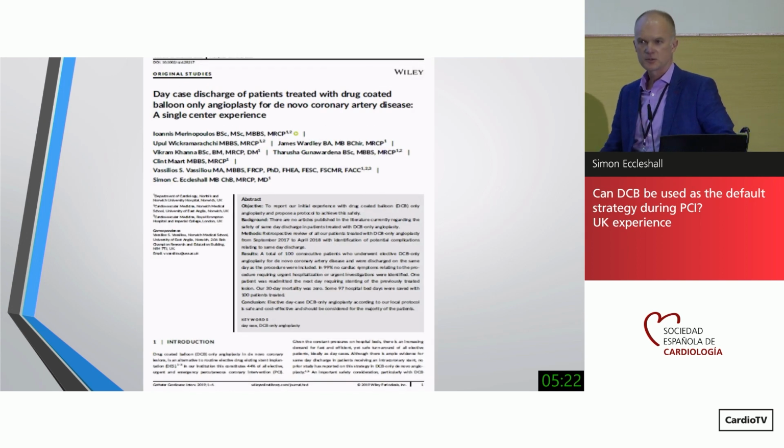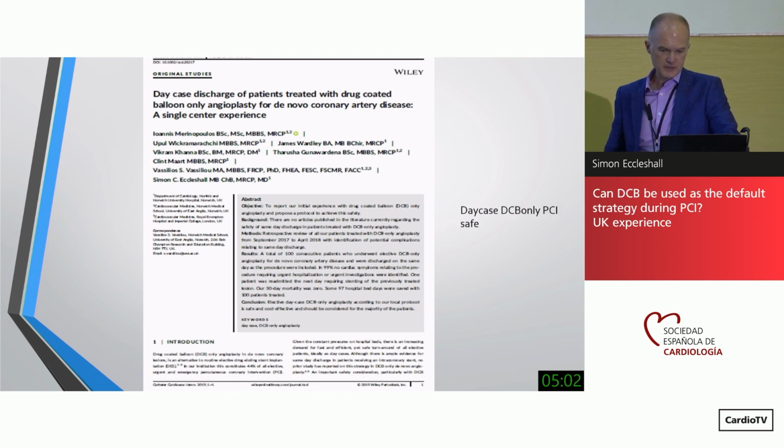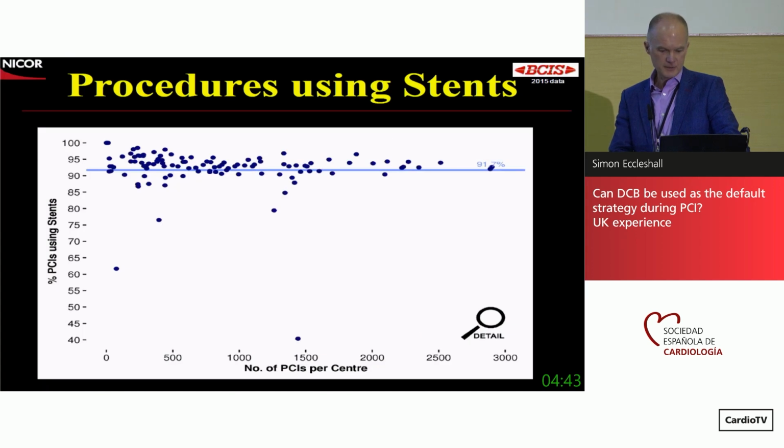One of the other things we did is, because people were always worrying about this concept of you're not putting a stent in, it can't be safe, you need to keep an eye on these patients. Again, in the UK, we have a massive drive to get people out as quickly as possible. So our elective programme is nearly all day case angioplasty. So we looked at a cohort of our patients that we were sending home within 6 hours of their elective angioplasty. 100 patients, 50 of them angiographically had good going type A, B and some C dissections, and again it was safe. So we got a little bit more ambitious then and thought there must be more things in our database that we can be looking at.